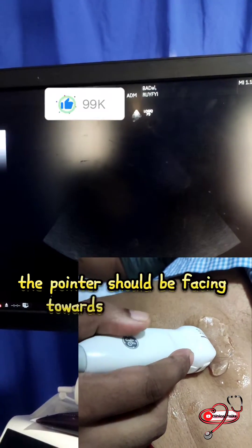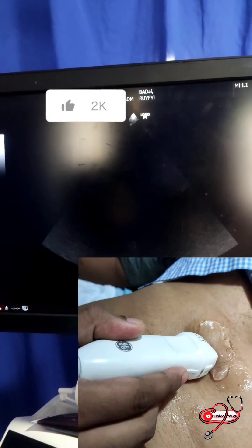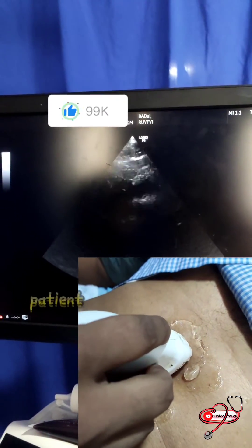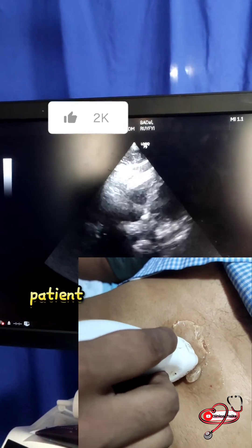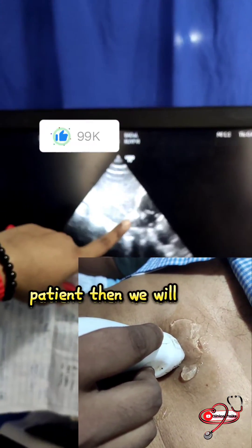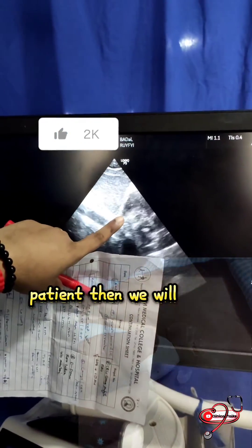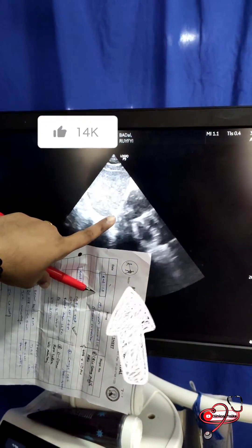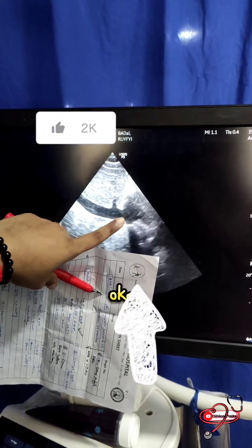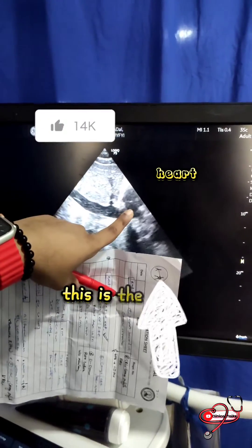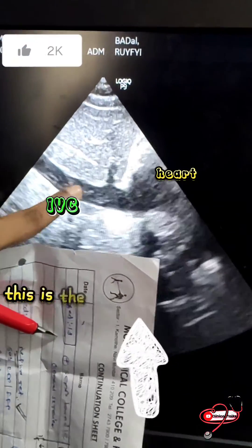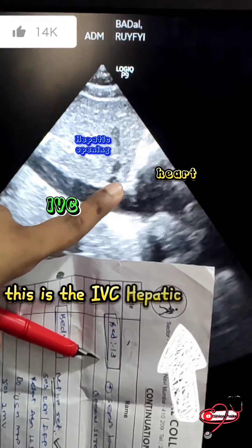Then we will turn to get the hepatic vein opening. This is the heart, this is the IVC, and this is the hepatic opening.